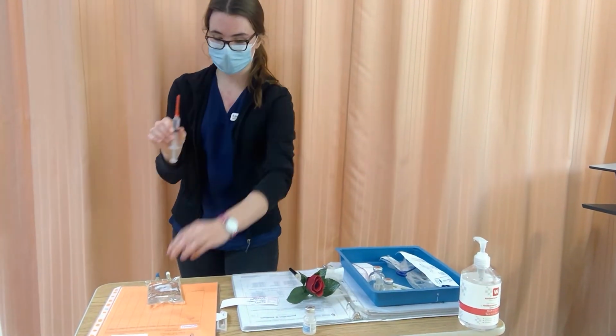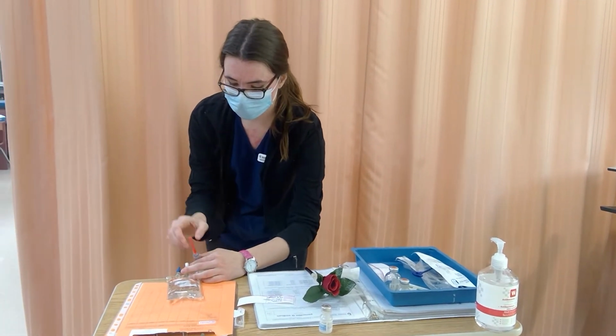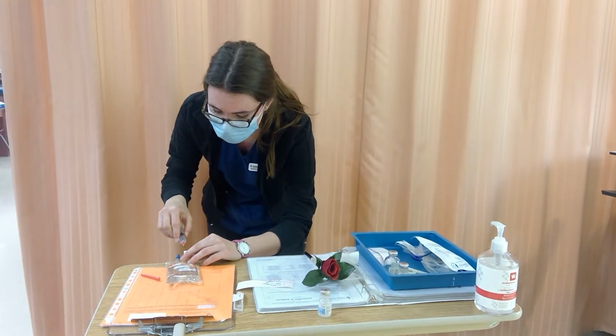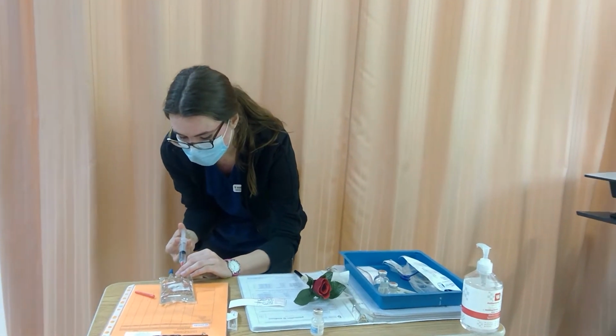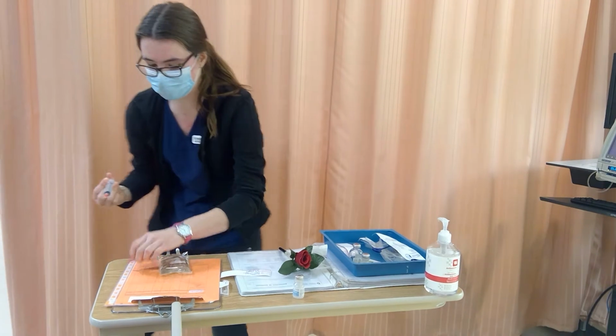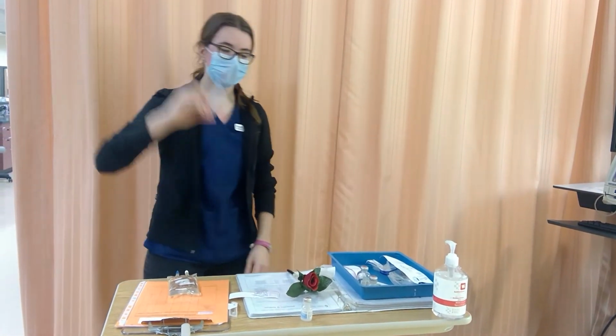Now I'm going to safely keep that up here so that it's not contaminated by the table, and then I'm going to uncap this and then insert straight on so that it's not perforating the side of the bag, and so we didn't contaminate either end or any part of the syringe there, so that we're keeping that aseptic technique. So now I'm just going to use the scoop method and throw this in the sharps.